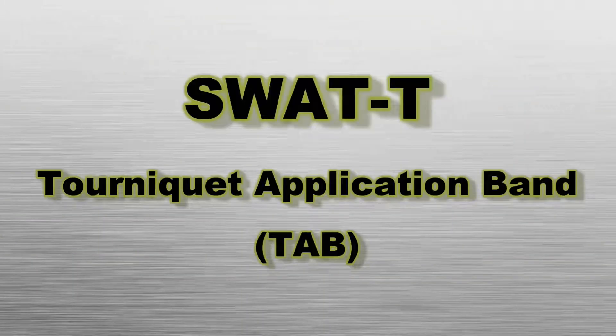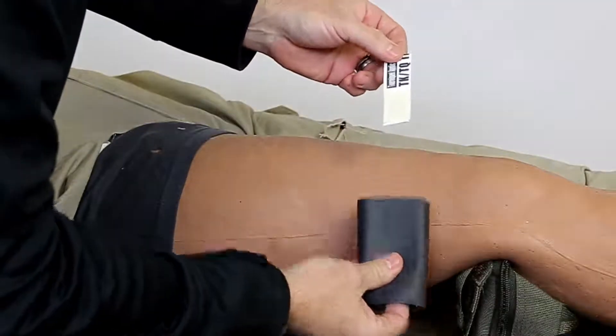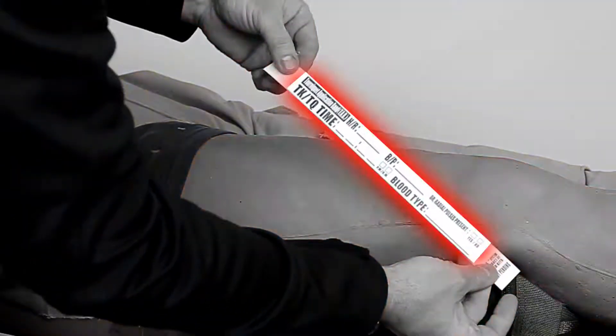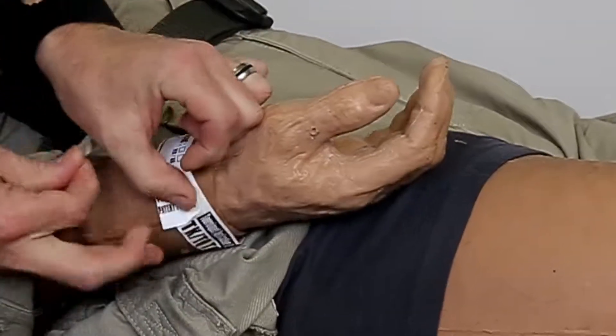The tourniquet application band is a patient information device located in the center of the rolled SWAT-T, which can be applied to the patient's wrist. Once bleeding is controlled, you may fill out the tab with appropriate patient care information, such as tourniquet application time, heart rate, blood pressure, blood type, and whether radial pulses are present. Please note that transport of a critical patient should not be delayed solely to complete the tab.